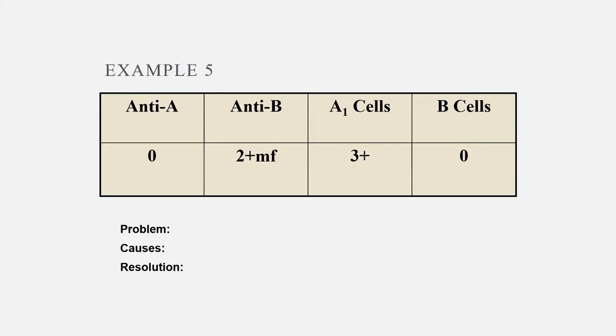And it can also be caused from a traumatic delivery. A mother could have fetus blood circulating in her blood, so she could have her type and the baby's type floating around. So lots of different reasons for mixed field. The other thing you do want to remember for board exam, the subgroups A3 and B3 are mixed field. So in this case, it looks like it's a B3.